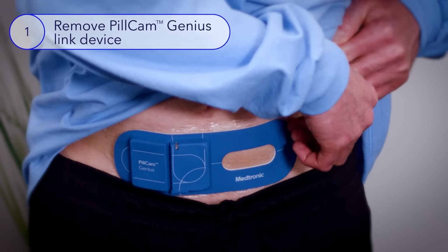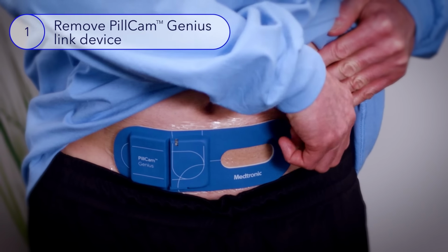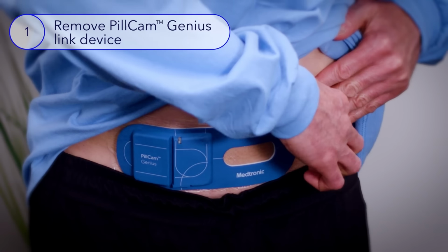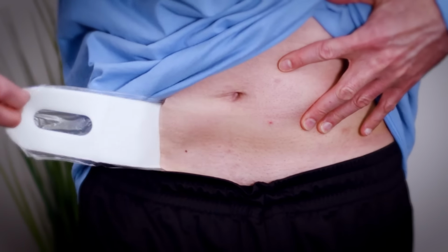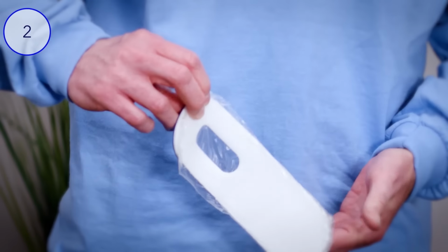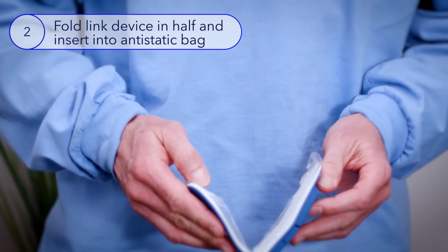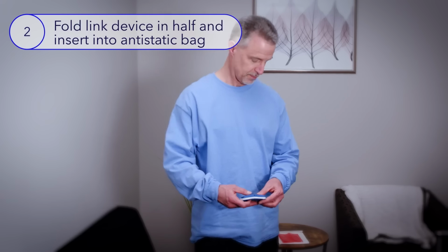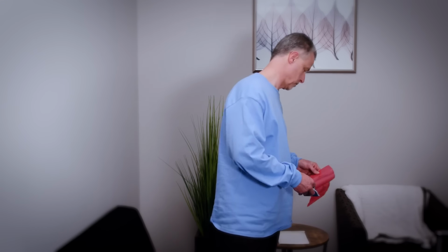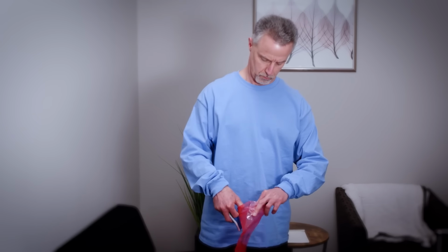The patient will remove the PillCam Genius Link device by gently lifting the adhesive from one side and gently pulling it away from the skin while applying counterpressure with the other hand. The patient will then fold the PillCam Genius Link device in half and insert it into the anti-static bag for return to the clinic per the instructions provided by your staff.